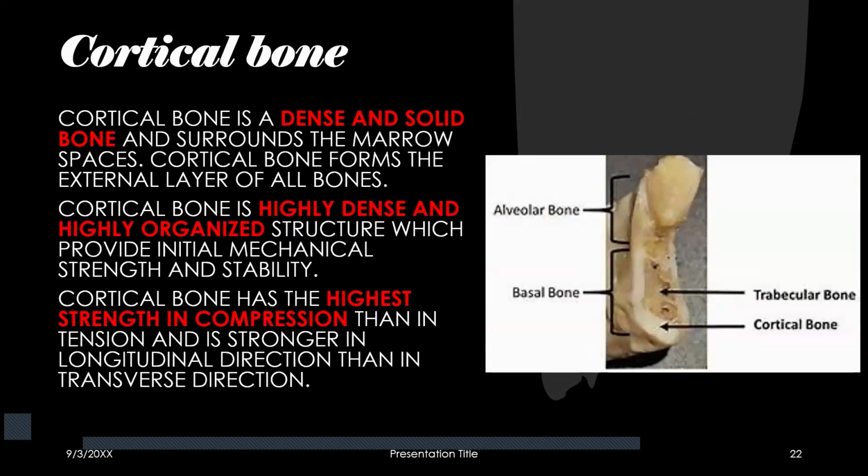The cortical bones are very dense and very solid bone. Now, if we see in this, it's the lower bone. This is the alveolar bone, or we can say the first cortical lies over here. And this softer part inside is your cancellous bone, where the two-piece implants are placed. All the two-piece implants are placed over here. And all around this hard bone is the cortical bone.